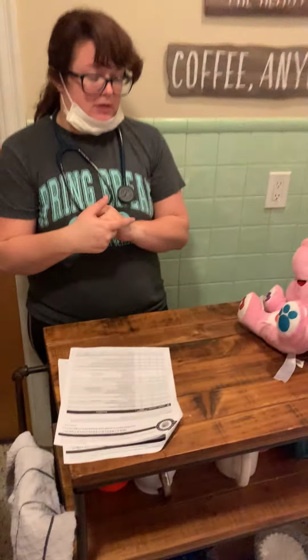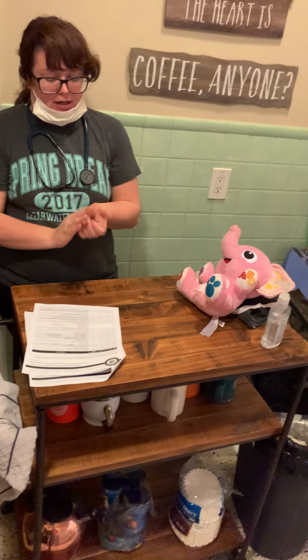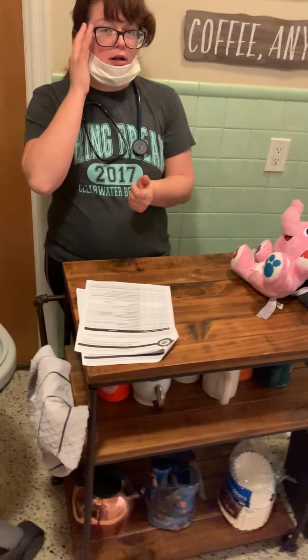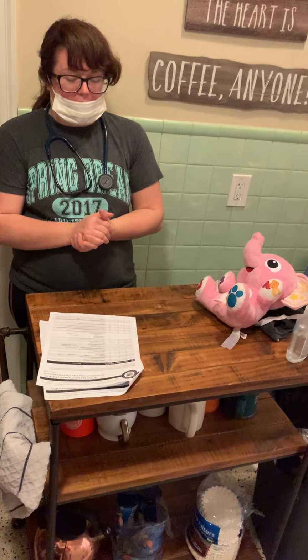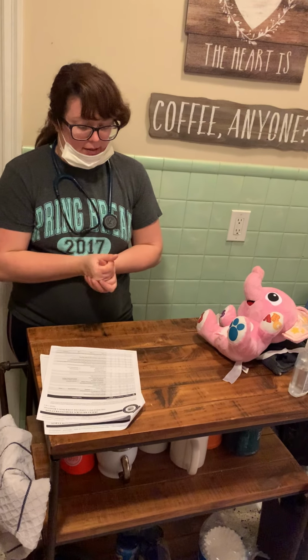Today we're going to be inserting a catheter for my patient, and I would assess for any need to do perineal care or cleaning of that area. I would answer any questions or provide any rationale that my patient might have, and then I'm going to obtain consent to perform this procedure on my patient.